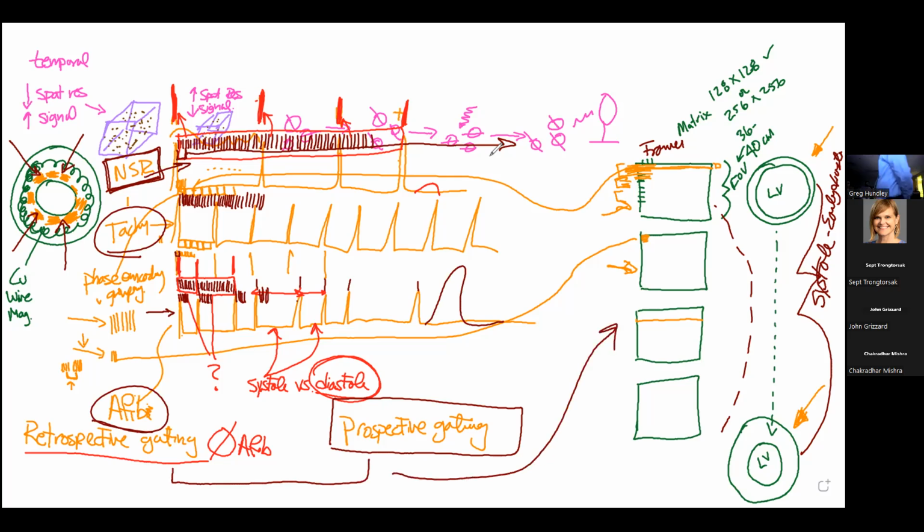You know, in the cath lab, when you're tracing your LV grams and you have a patient with sinus rhythm, you end up tracing 1. If you have a patient with atrial fibrillation, you have to trace, I don't know what Zach and Barbara make you do, but in my days, you had to trace 10 and average them. In the echo lab, if you're going to be calculating volumes, on the routine echoes, we trace 1 cardiac cycle. If you've got somebody with AFib, we do multiple, should be 5.